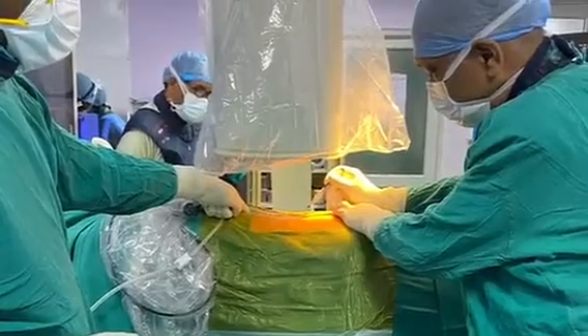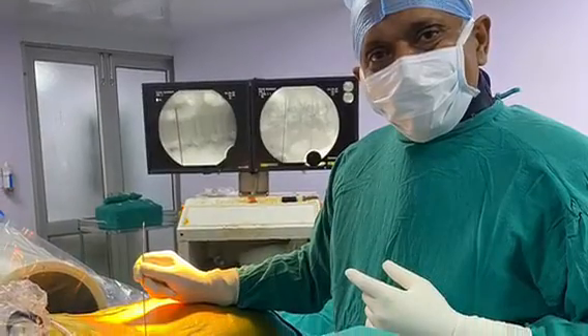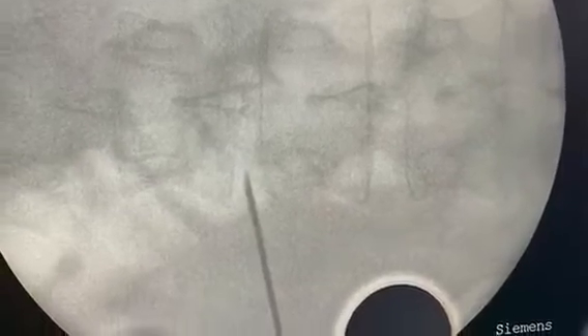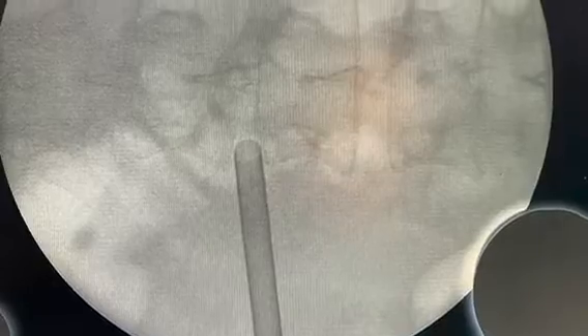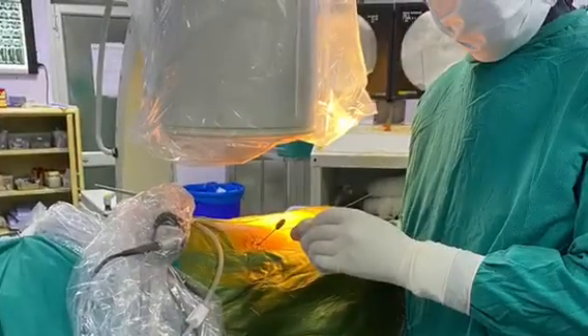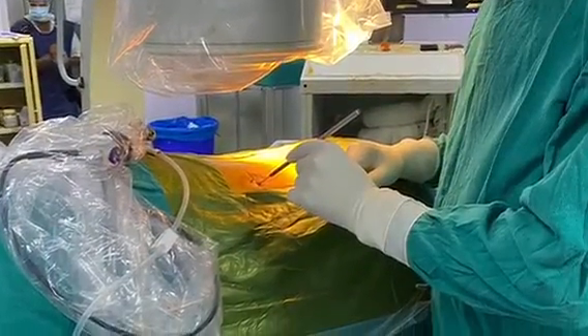The first step is marking the level of the disc, then we put the needle inside — the tip should be exactly where the disc is coming out. We then pass a guide wire and over that the working cannula, and we are ready to take the endoscope inside to the level of the disc. The entire procedure is watched on a monitor at 20 times magnification, making it very safe — nerves that people fear may get damaged look like a big rope at this magnification.